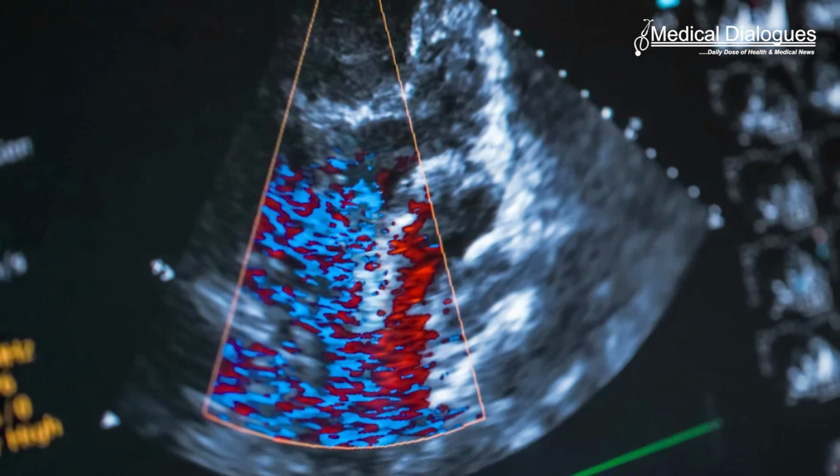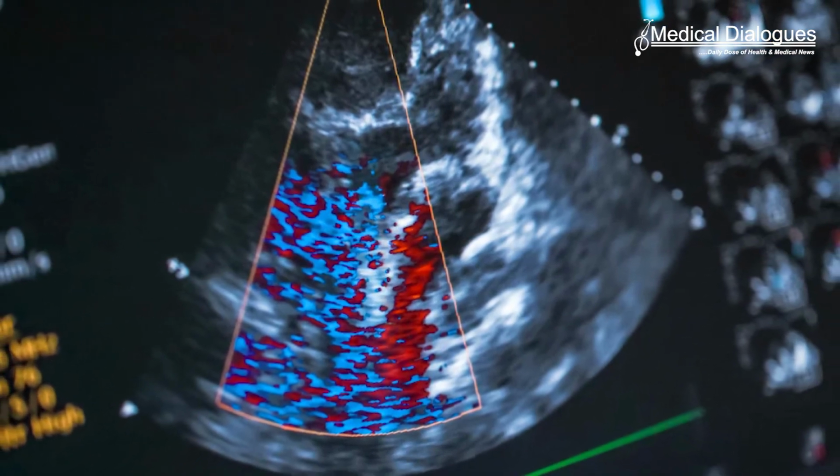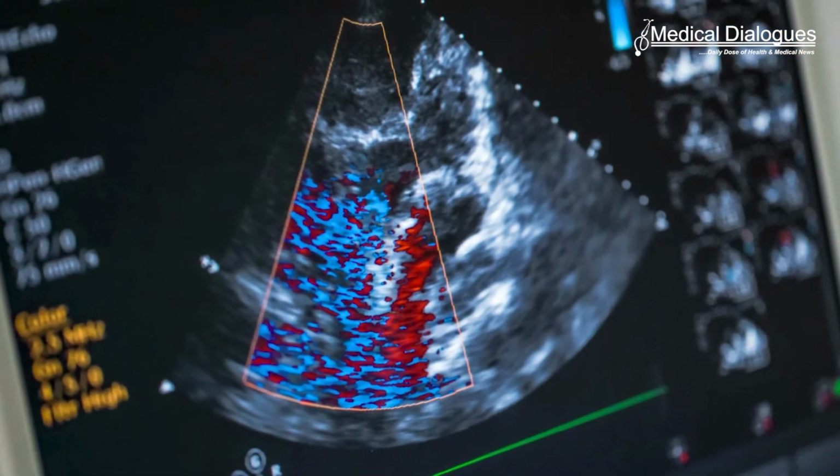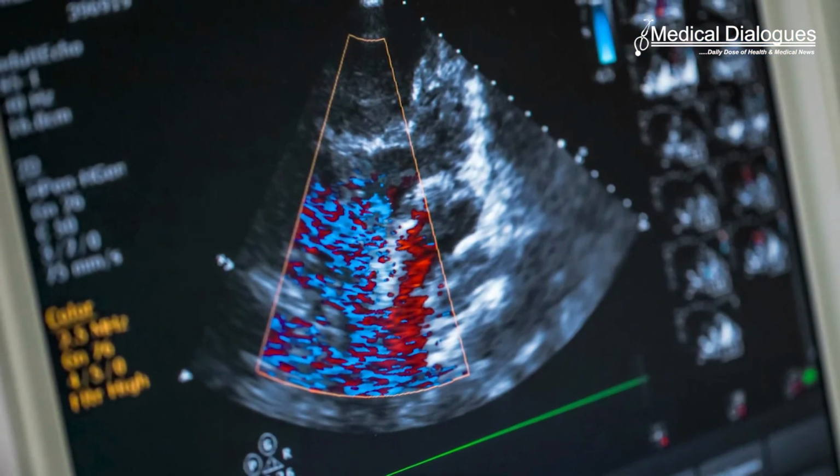Although at times atypical location and unusual morphology may pose a diagnostic dilemma with 2D echocardiography, 3D echocardiography, with its multifaceted advantages including multiplanar cropping abilities and superior imaging quality, can help distinguish between a clot and a myxoma.